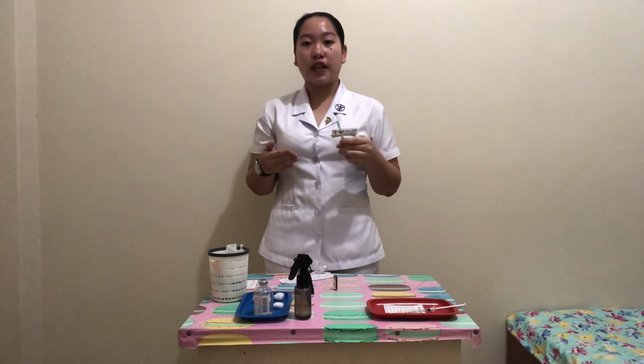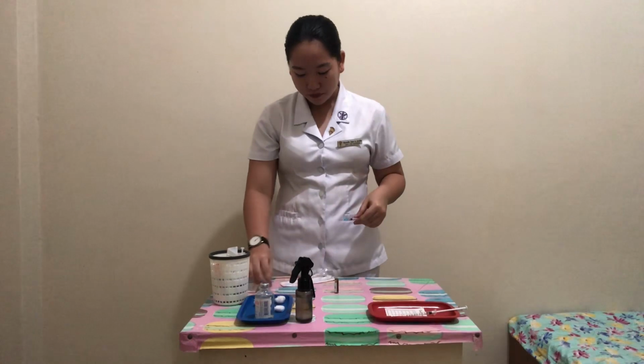And now we're going to remove and turn the syringe upright and flick it to get the air bubbles out. And then push up the plunger slightly to the prescribed amount. And now remove the aspirating needle and dispose of it in the sharps container.